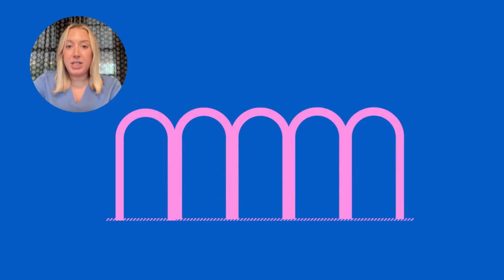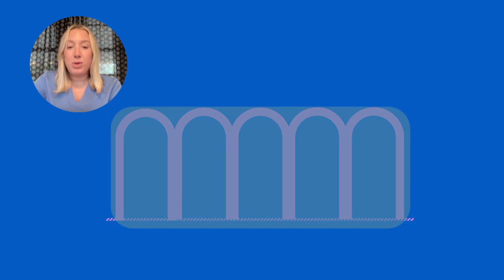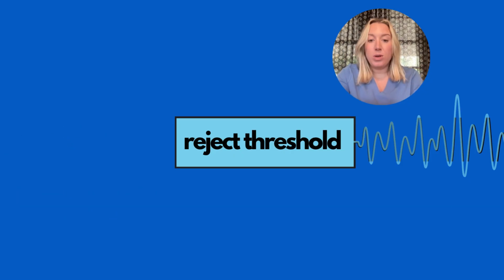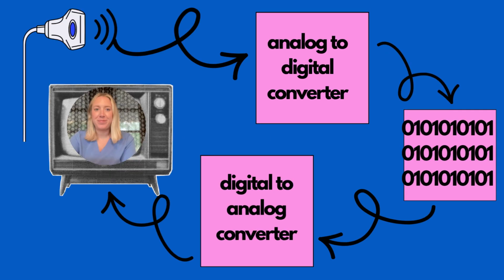The fourth function is demodulation. This is a 2-part process. First, rectification converts all negative voltages into positive ones, and then enveloping or smoothing creates a smooth line around all the bumps to even them out. This actually has no effect on the image. The fifth and final function of the receiver is reject. This allows the sonographer to determine whether low-level signals are meaningful diagnostic information or just meaningless noise. This is also called threshold or suppression.